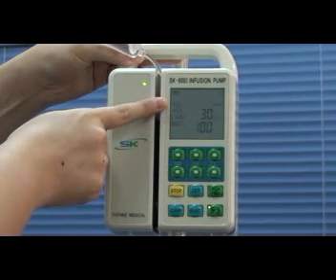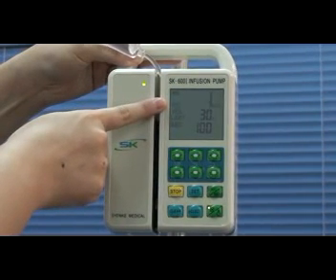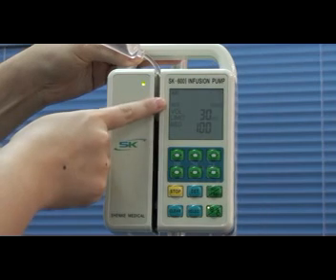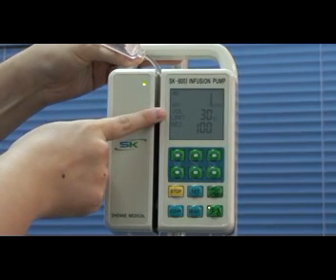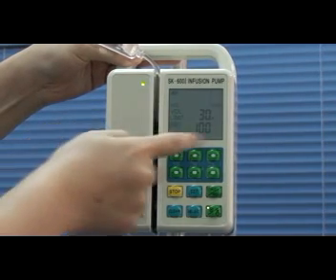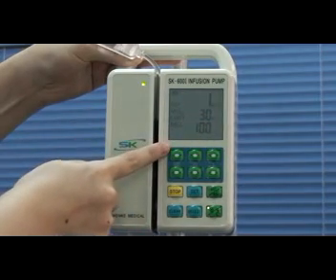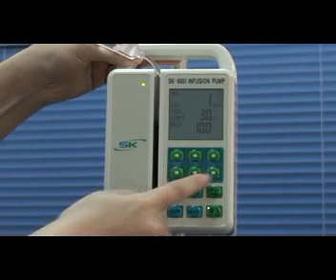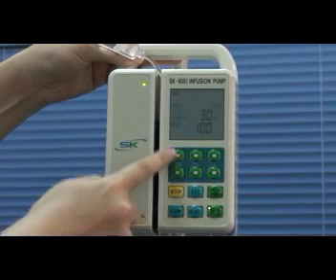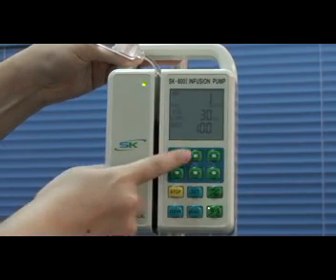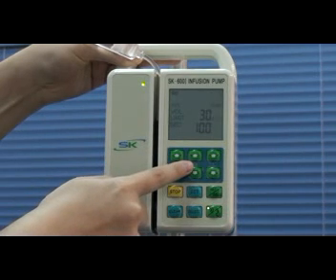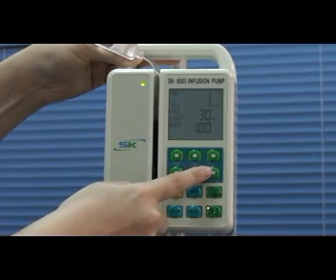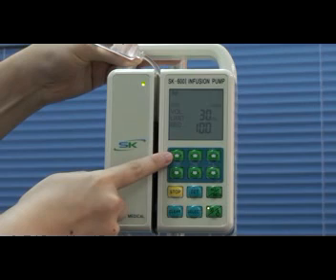Now we need to adjust the flow rate into 250 ml per hour. The volume limit to be 10 ml. How to adjust the parameters? We adjust them through number keys. Here you can see there are up and down 100 keys, up and down 10 keys, up and down 1 key.